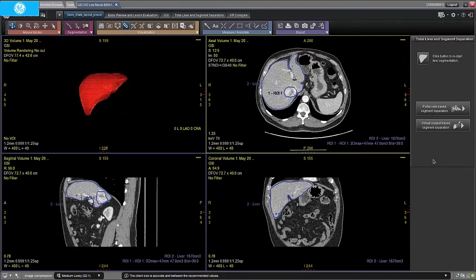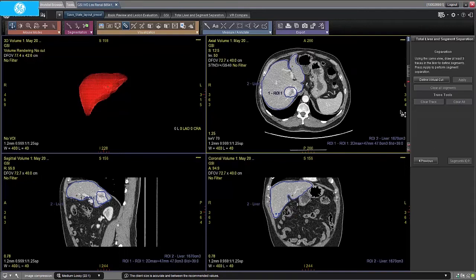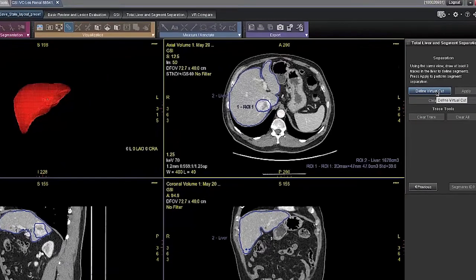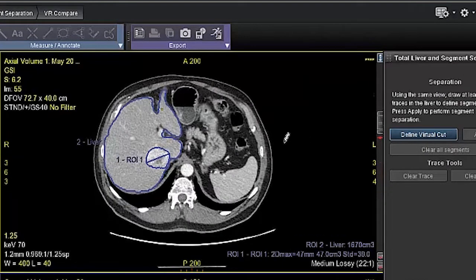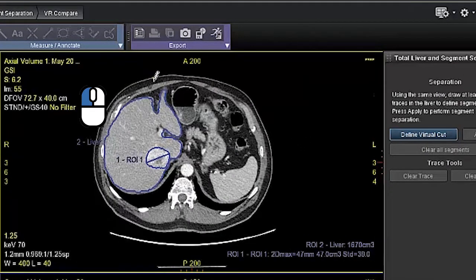We will start with virtual scalpel. In this example, we will separate the liver into left and right lobe and the left lobe into two segments. Using the same view, we need to define at least three traces in the liver to define each of the segments or virtual surgery that we wish to simulate. To define each trace, left click on Define Virtual Cut and then click and hold on the left mouse button to apply the virtual cut.